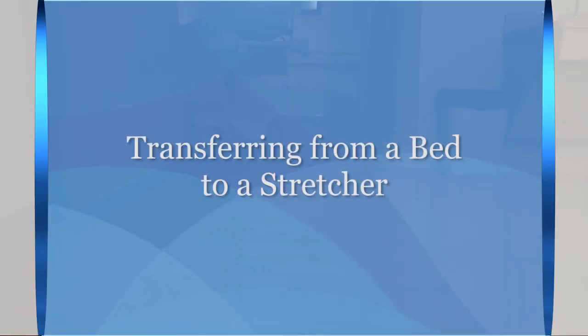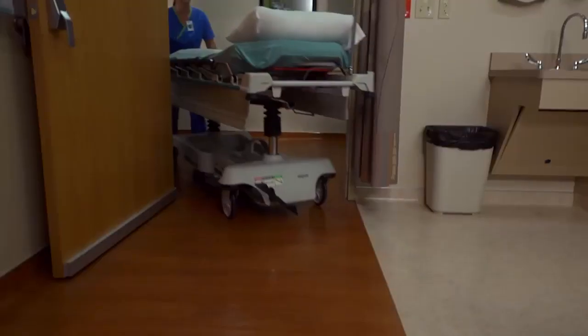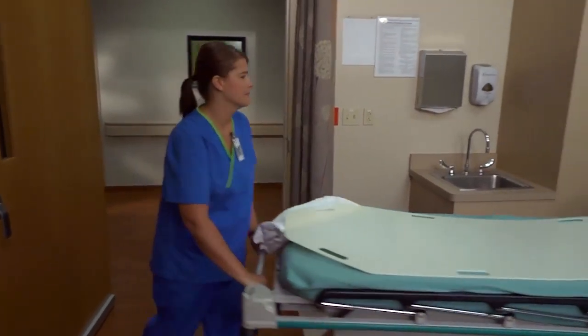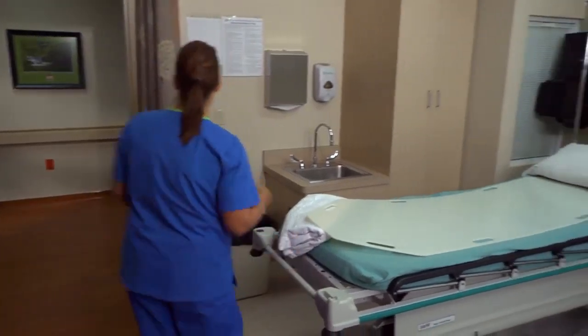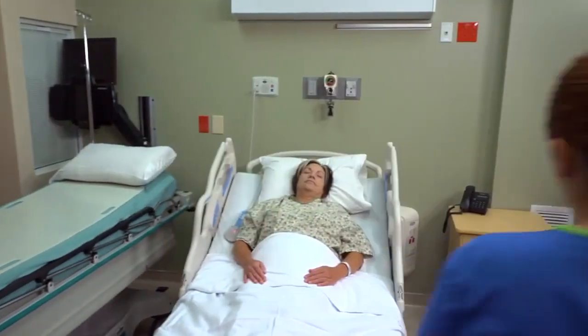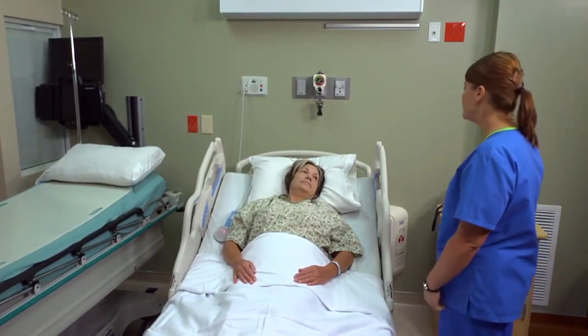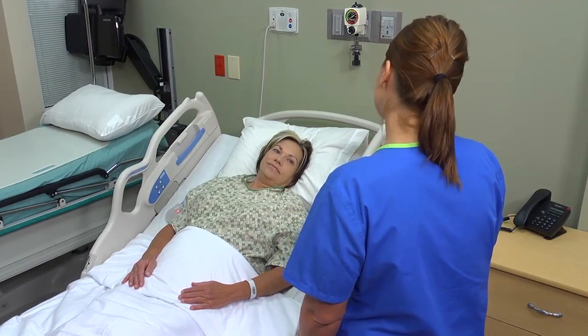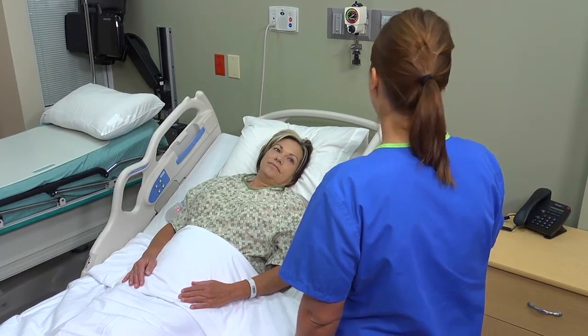In the following demonstration, the term assistant is used to refer to additional staff members required to help the nurse safely move the patient. Please keep in mind that any member of the nursing team can provide this assistance: RN, LPN, NAP, or other staff member. The assistants in the following video are actually RNs.